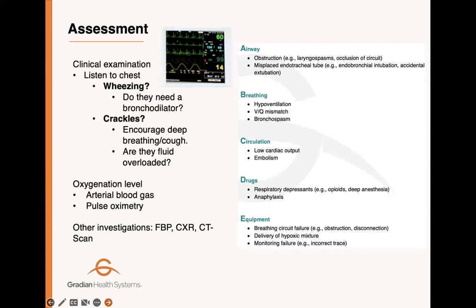So you have to look at your mixture, and you should look at the trace of the monitors to see if there is a monitor failure. So you start with the patients and then you go to your equipment, if there is a fault in the recordings on your monitors. Next slide.